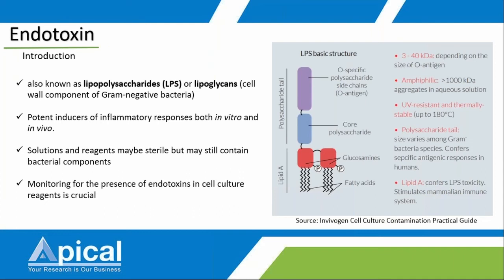All right, so for endotoxin, the main source where you find them is carryover contamination from your plasticware. So for example, your beakers, stir bars, or any other labware that is used.